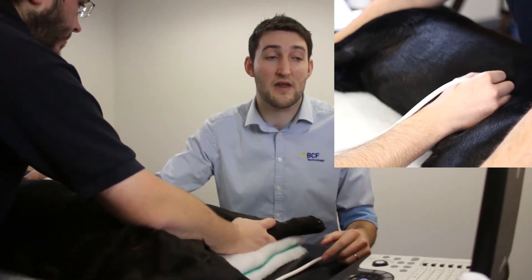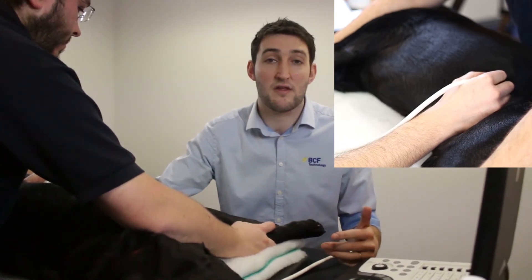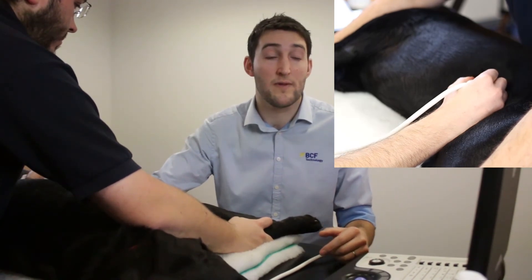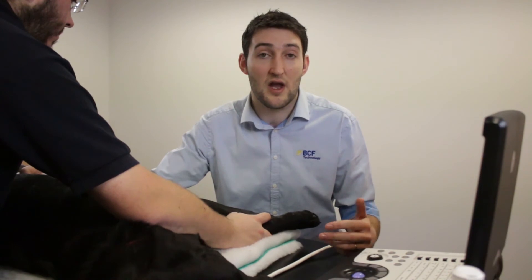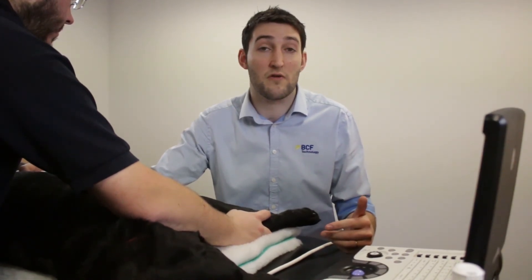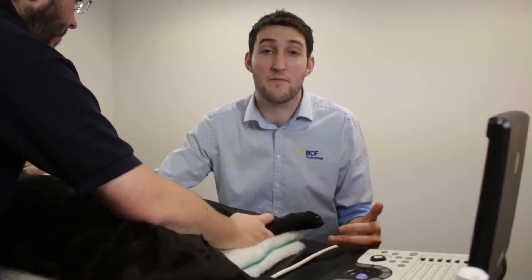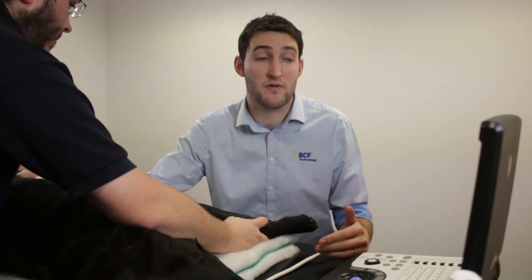The key there is to try following them and rotating the probe to see if we can change them from being circular in cross-section to linear. If you have colour Doppler on the machine, you can turn that on and see whether those structures have obvious flow — clearly there would be no flow if you have free fluid in the abdomen. If we're spotting fluid at all, that's considered to be a positive result.